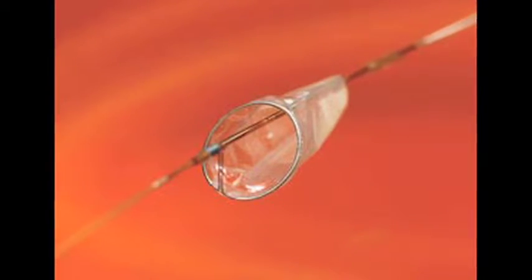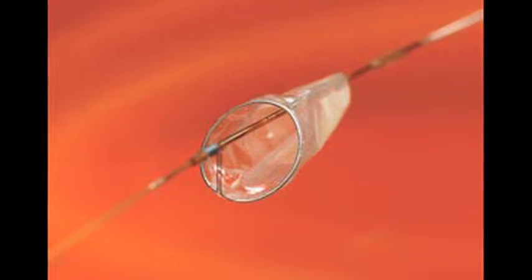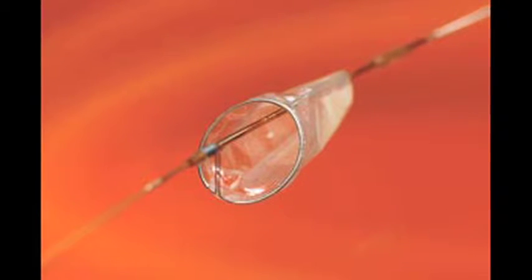In the early years of carotid stenting, in fact, a lot of times stents were not even used. A simple angioplasty was performed whereby the artery was dilated in the hopes of achieving a better quality artery, and that turned out not to be effective. We then developed the use of stents to trap the debris so that debris wouldn't go into the brain. And ultimately, the final leg in the maturation of carotid stenting is using some sort of protection device whereby that debris that Dr. Voice was talking about doesn't go into the brain, but gets trapped in some sort of filter or net and can be retrieved at the end of the procedure and protects the brain.